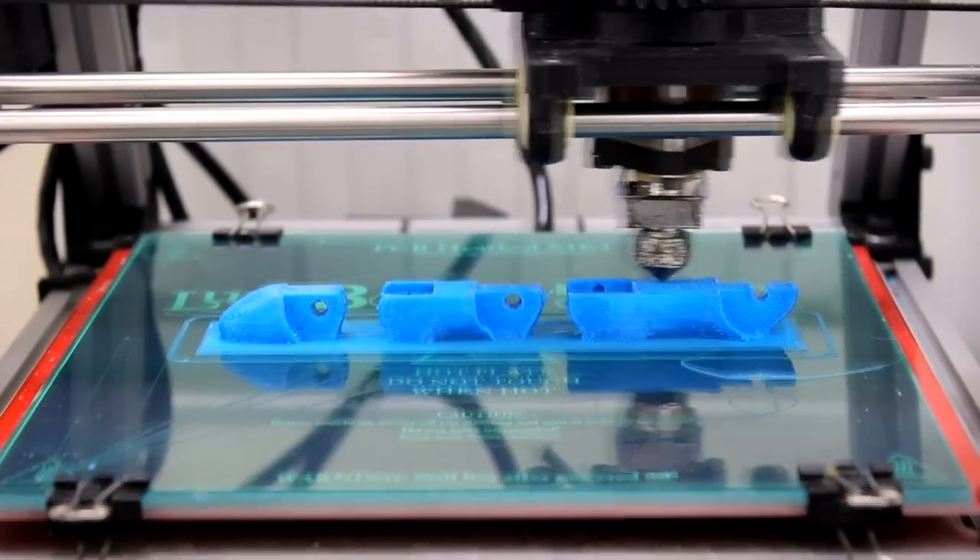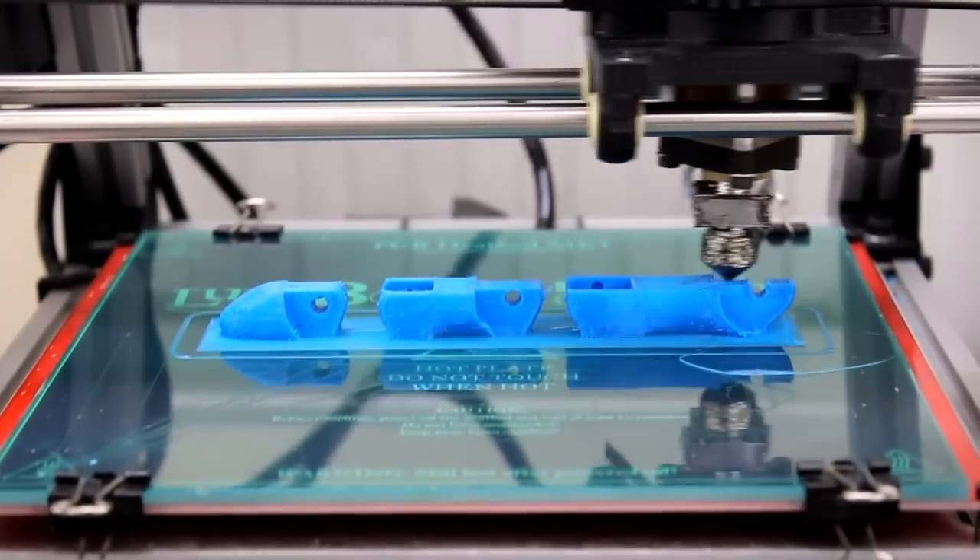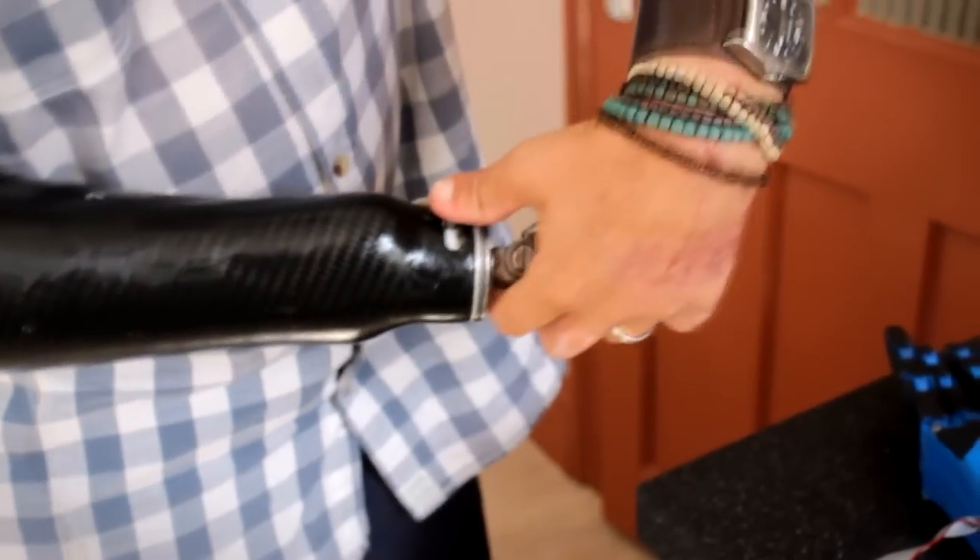To avoid the need for custom fitting, the Dextrous is built so that it can connect to an existing prosthesis.